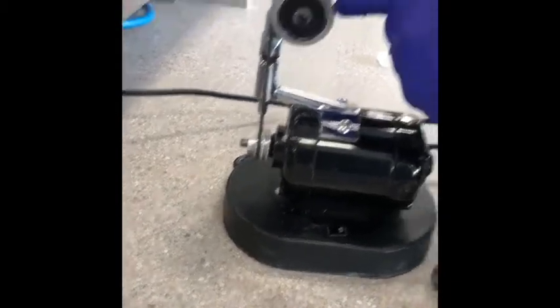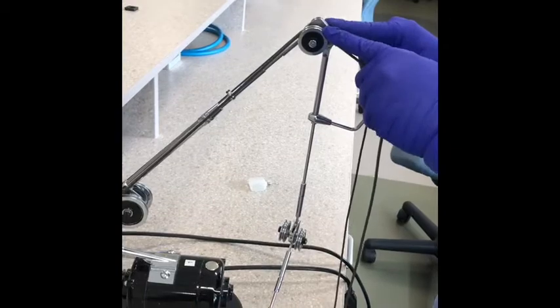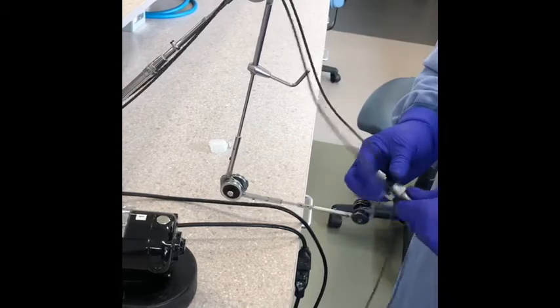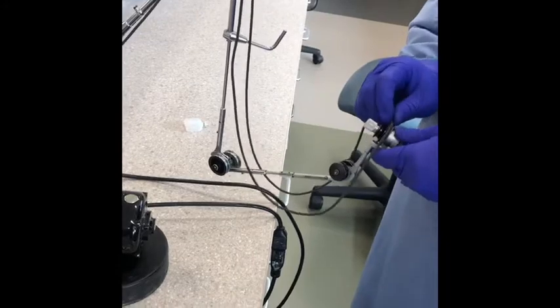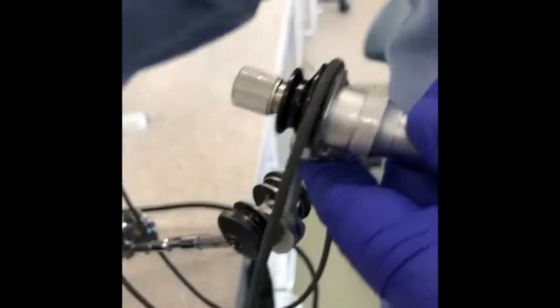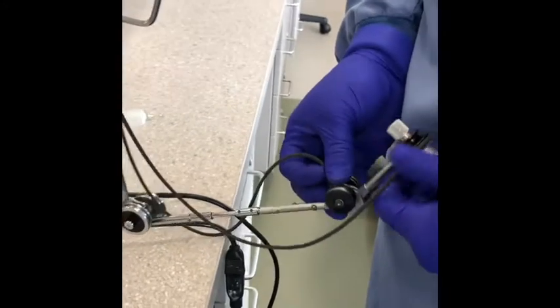We're gonna place it on the outside groove there, and then we're gonna go over, over, under, under. So over the top of those, over the top of the next one, and then for the last two that are closest to the handpiece, we go under, under. So what that means, I think it's easiest to attach the rope on the handpiece and then do the last two. So this is where I was talking about the two grooves. You do the opposite of what you did at the back. So I went on the outside groove in the back. So at the handpiece, I need to go on the inside groove here. And then on the last couple joints, we're going under, under.